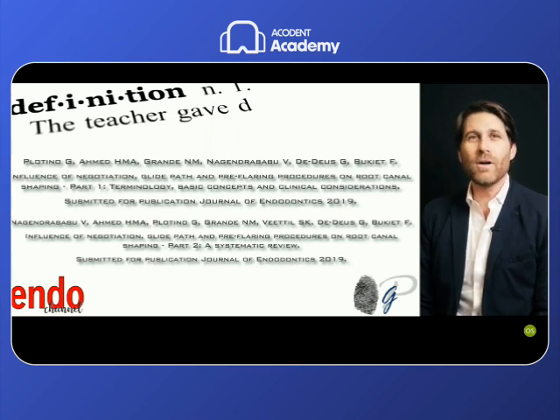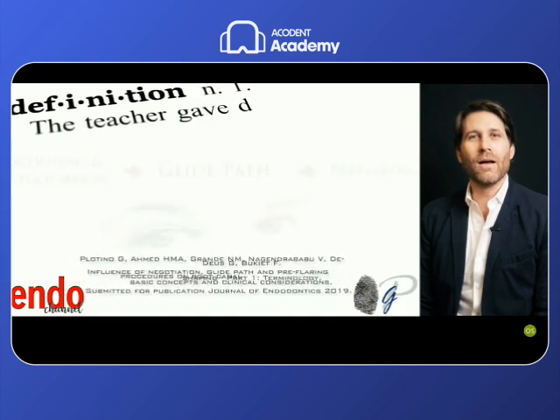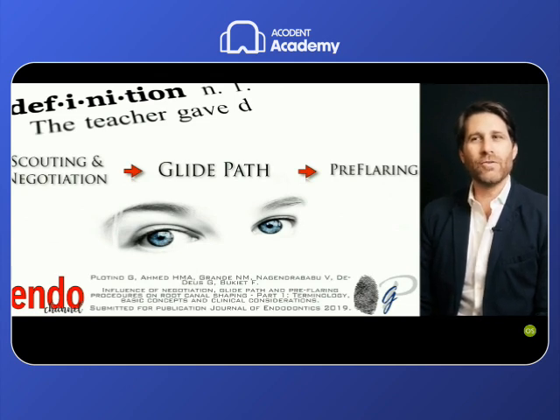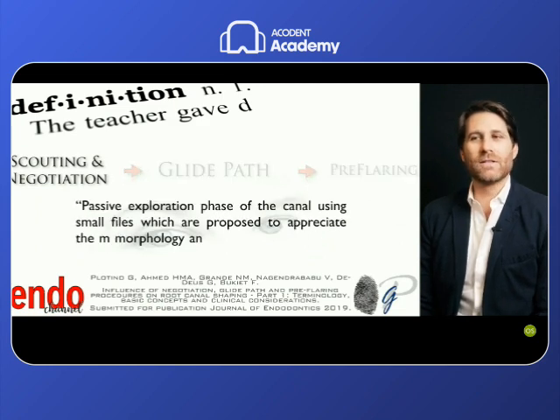Here, I hope you will find these definitions very clearly in a scientific article. When we speak about this phase of endodontic treatment, the initial steps after the access cavity and the orifice location, we are speaking about scouting and negotiation, the glide path, and the preflaring. So I want to give you the definition of these steps.